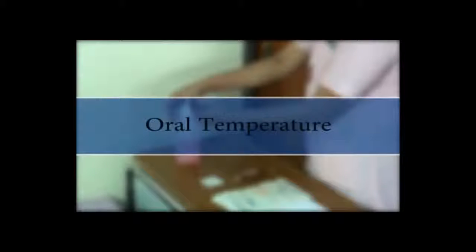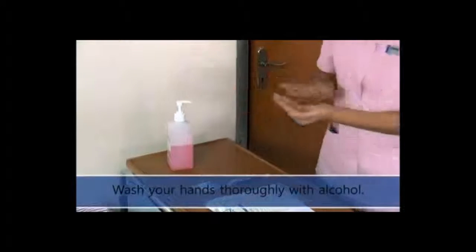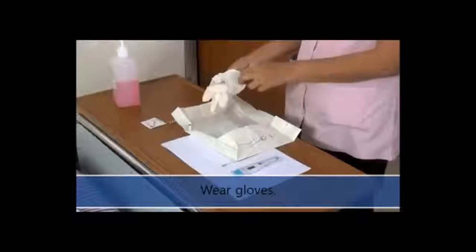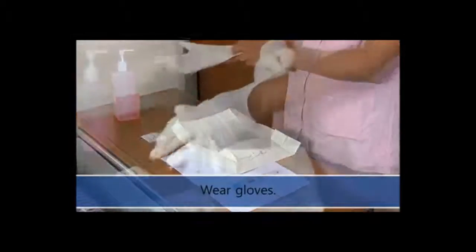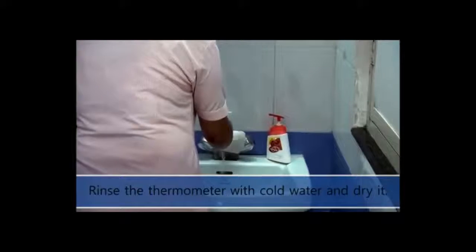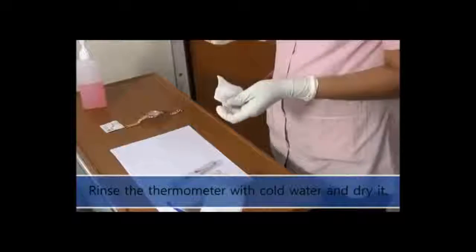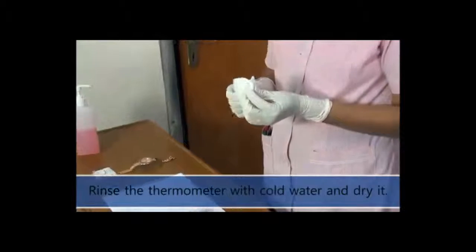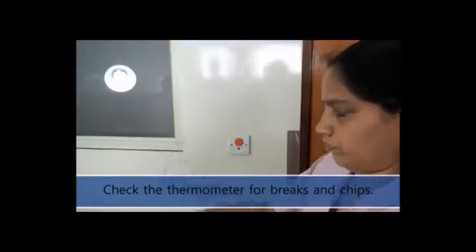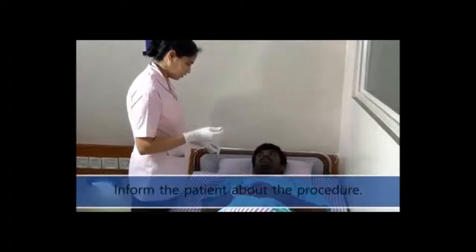Measuring oral temperature. Wash your hands thoroughly with alcohol solution. Wear gloves. Rinse the thermometer with cold water and dry it. Check the thermometer for breaks and chips. Inform the patient about the procedure.